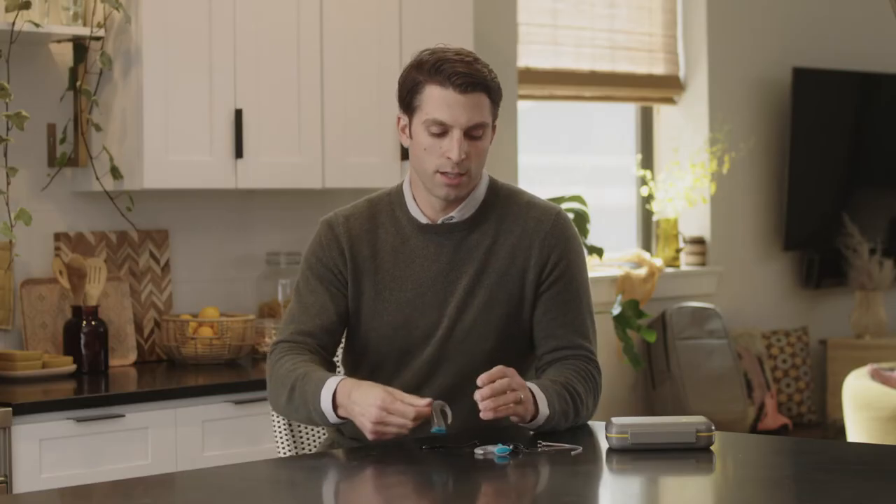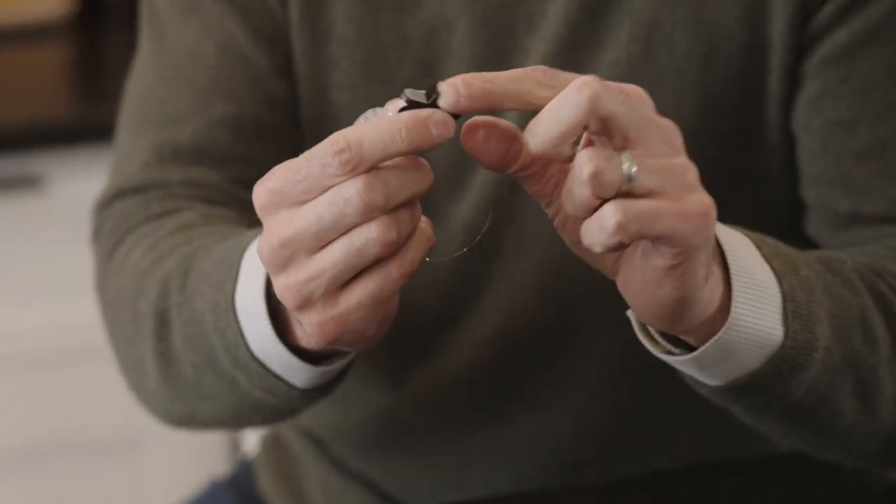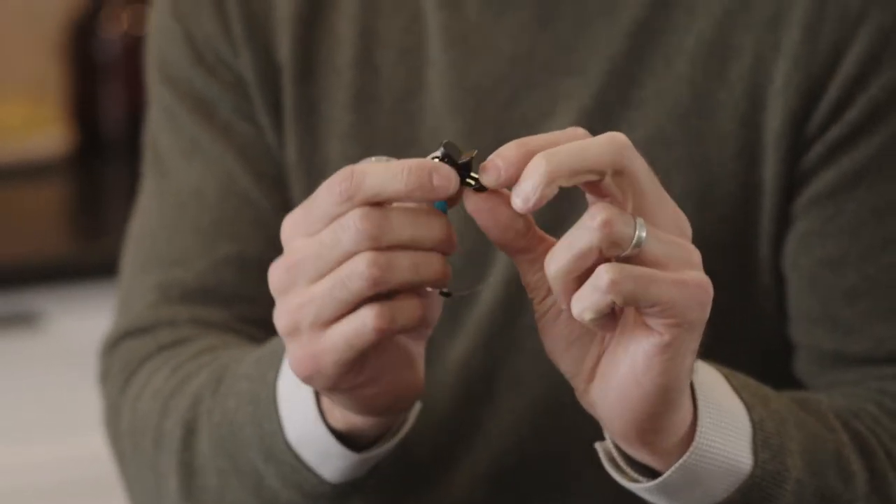For retention, you can use the included safety line. For demonstration purposes, I have one pre-threaded and attached to the Aqua Plus. To attach the shirt clip, lift up on the small lever to open it and then attach it to your shirt and click it shut.